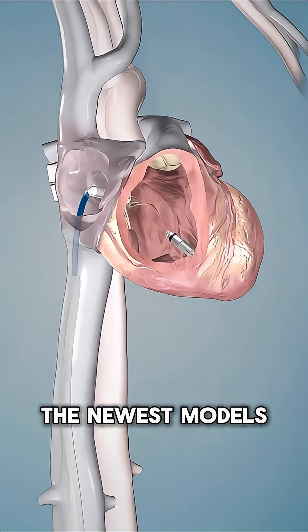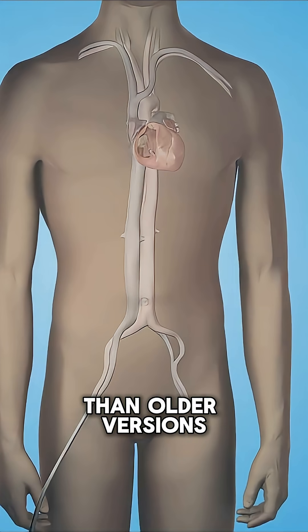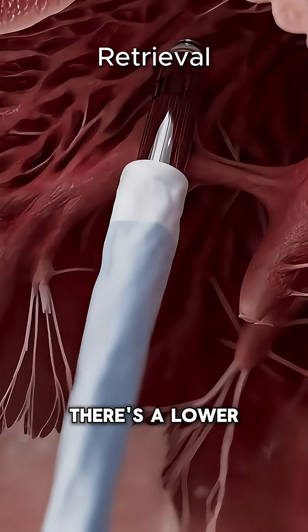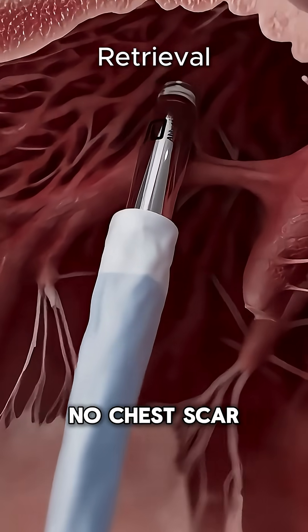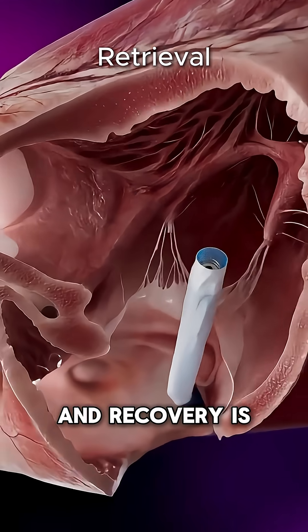The newest models last up to 17 years. That's 40% longer than older versions, and they are retrievable. Without wires, there's a lower risk of infection, no chest scar, no lead-related complications, and recovery is often quicker.